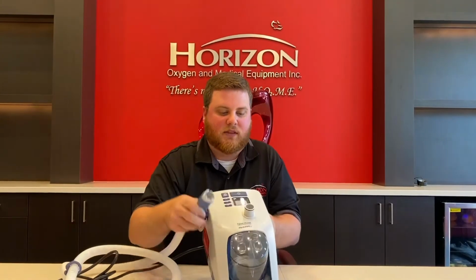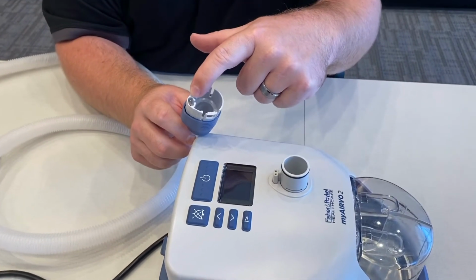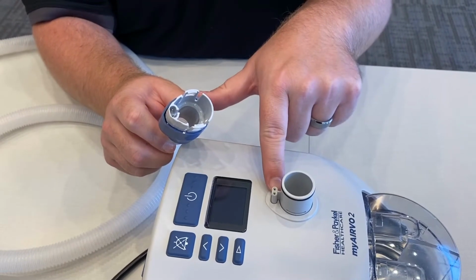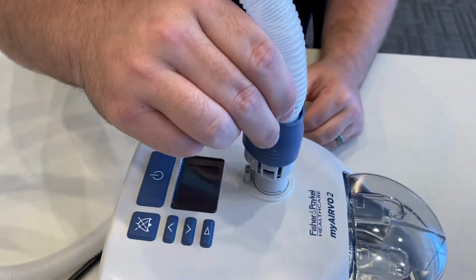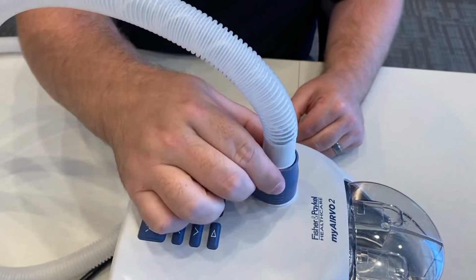So we'll correspond the top of that tubing to the top of the machine. You can see that little spot. If we look at the top of our tubing, we can see where it matches up. We have the electrical probes right here at the top. It corresponds with the electrical inlet for the tubing here. So we'll slide this right over the top, inserting those probes inside that inlet, and then we cover that. And then we have an interface.